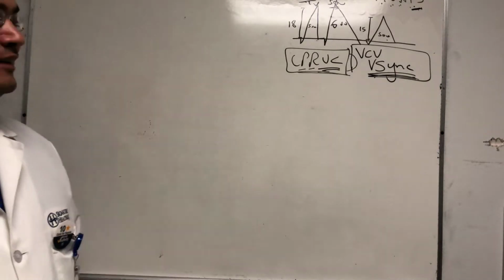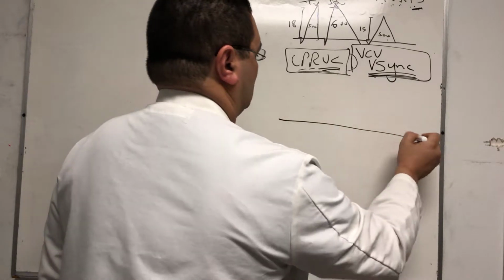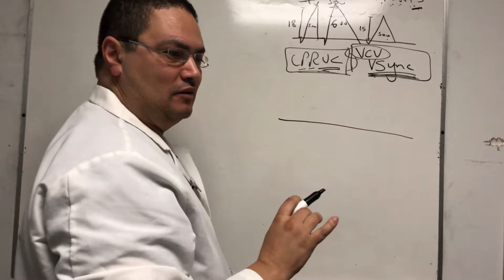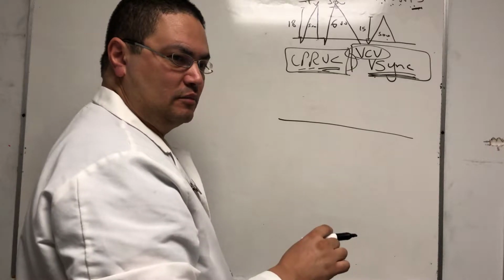No bellows. Right? So how does it work? You order the regular settings for volume control. You're not going to feel any difference in the ordering for volume control. The tidal volume, the FiO2, the respiratory rate, and the PEEP.